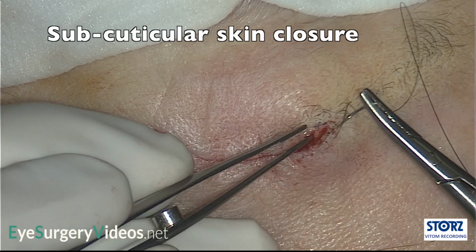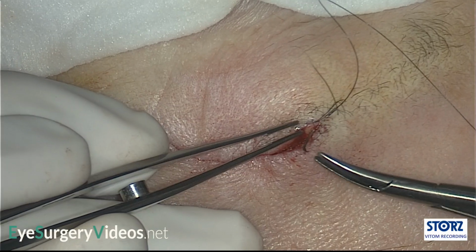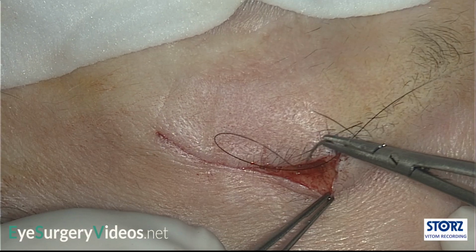The skin is carefully closed. This video shows a continuous subcuticular suture, although interrupted or a simple continuous suture may also be used.